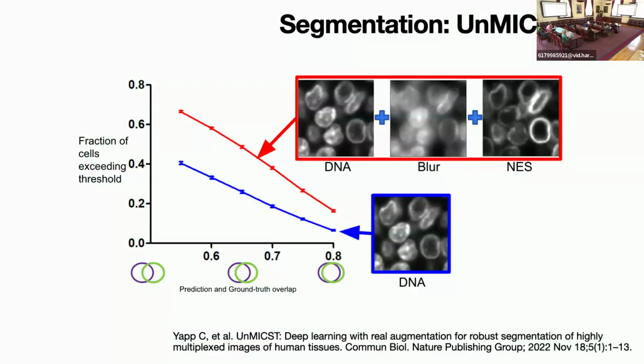He had the idea, what if we actually take physically blurred samples and we'll actually drive the Z stage of the microscope up and down by 3 microns for every image that we take, have the humans annotate the focused image, but then use the physically blurred data in the training set. That actually worked a lot better than just Gaussian blur your image. So for whatever reason, using the actual OTF of the microscope actually gave better results than just a sort of fake one. Who knew?